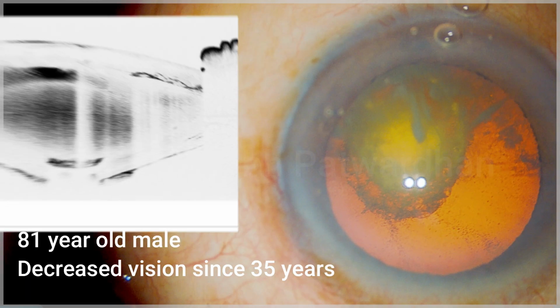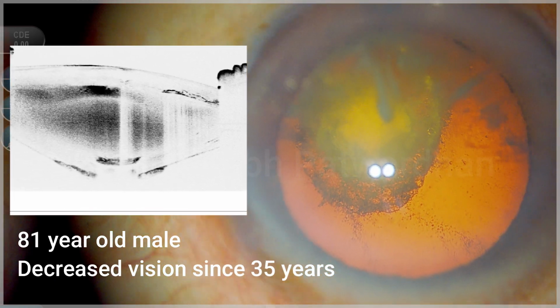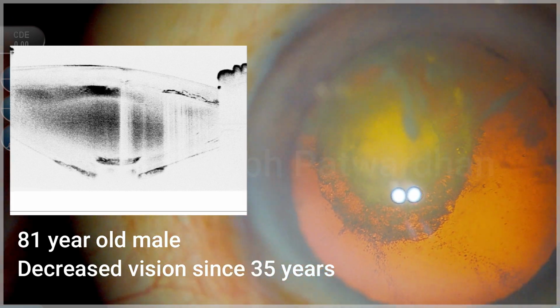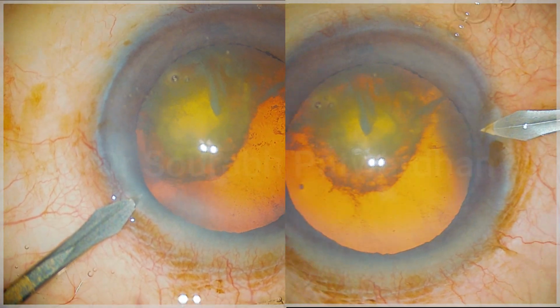So you can see now on OCT, this is a type 3 PPC because you cannot see the central posterior capsule at all and the density is there in the central part and you can see the dense central posterior plaque there.